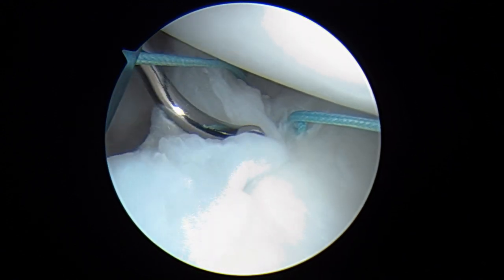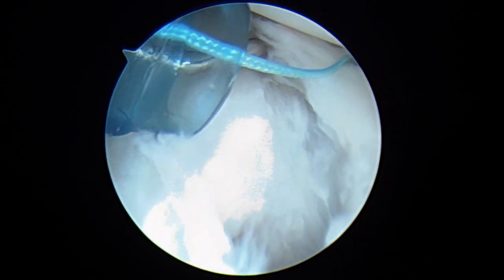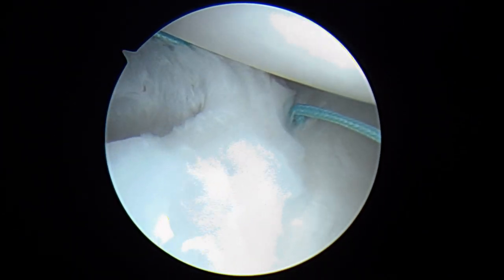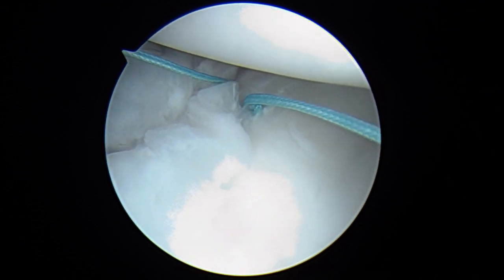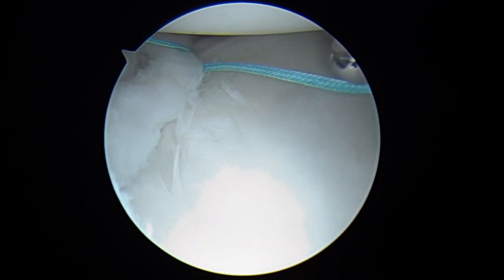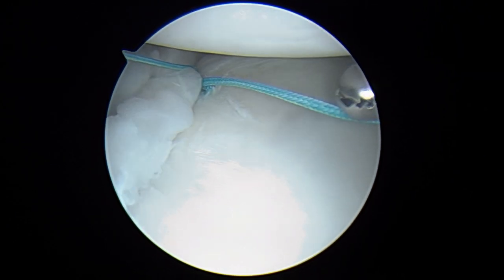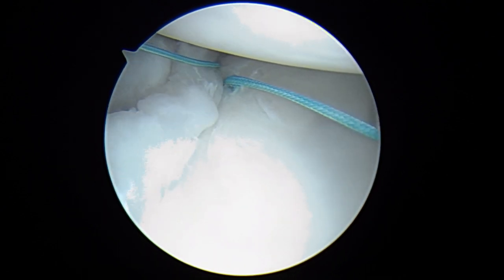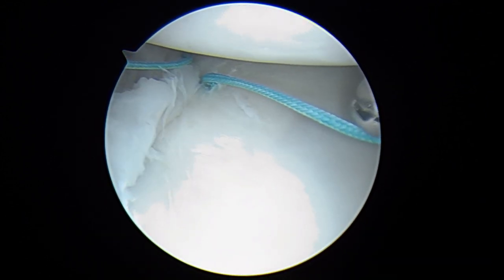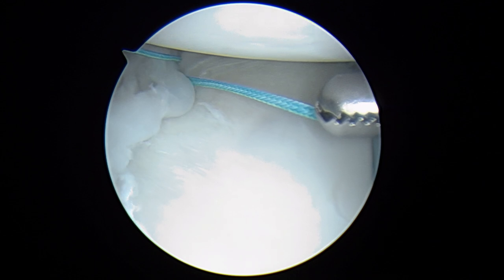Now we're going to make our second pass. This time we're going to go into the anterior capsule about here. You can see us bring that through and then come underneath. I want to get just a shade deeper than that — I think that's pretty good right about there.